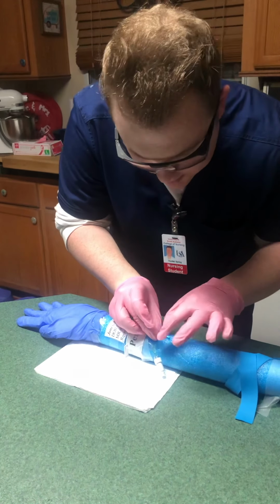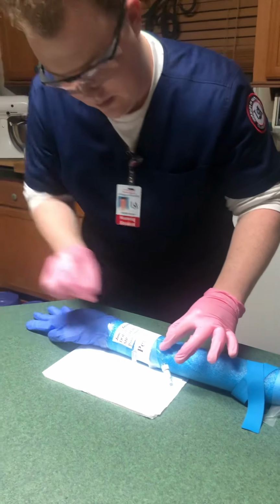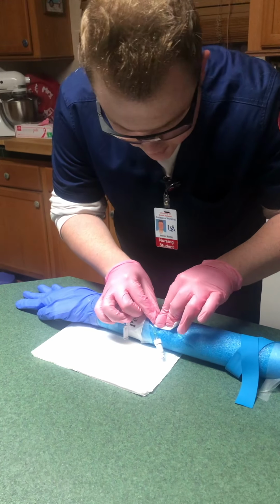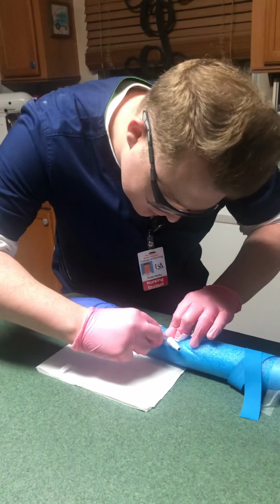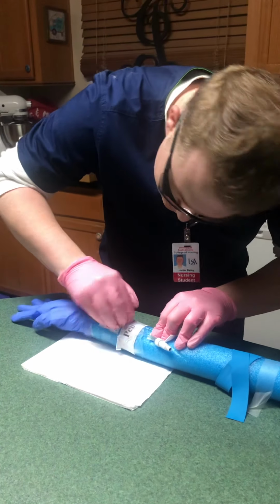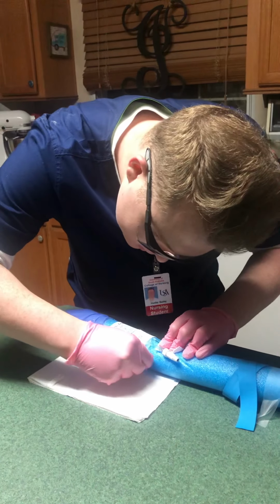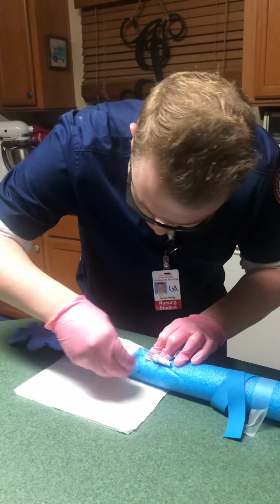There we go. And I'm stabilizing the catheter. And now I am going to stabilize it with my hand. I'm going to get a 2x2 gauze and hold pressure right here while I take off the other tape. Sorry, the tape is just really sticky on the pool noodle.